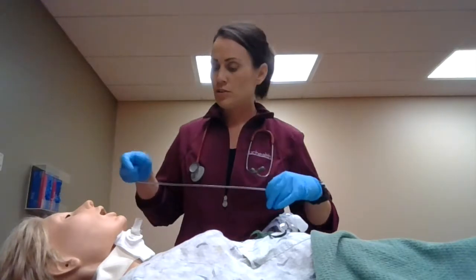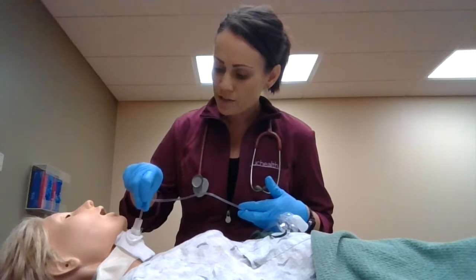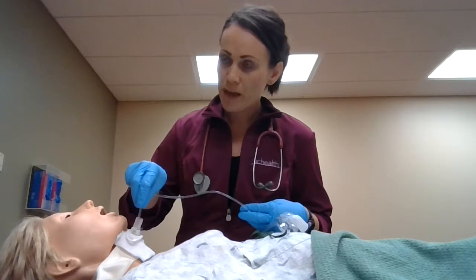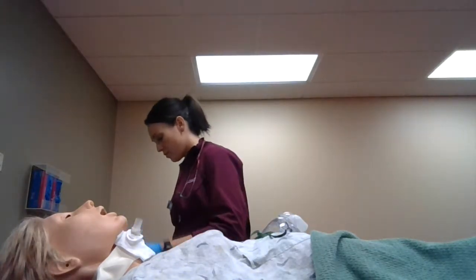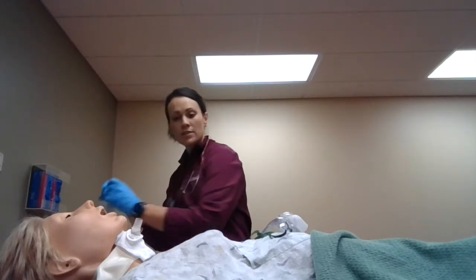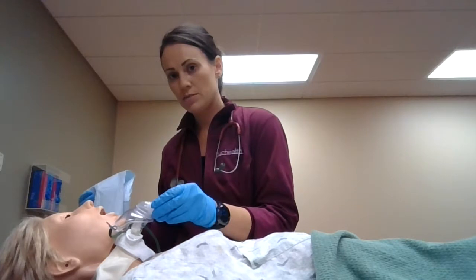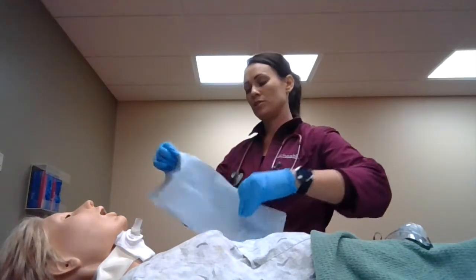I'll make sure we have lube on the tube and go ahead and insert. Feel a little resistance, pull back a little bit, then include the thumb port and suction. Now we can go ahead and use aseptic technique. I'll go ahead and check if she needs to be oxygenated again. Meanwhile I'm looking at her vitals, making sure her breathing is good and saturation is good.